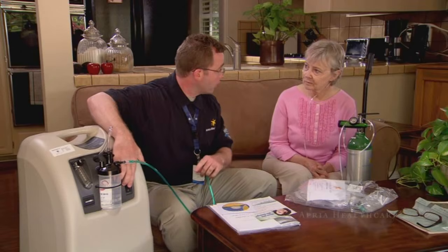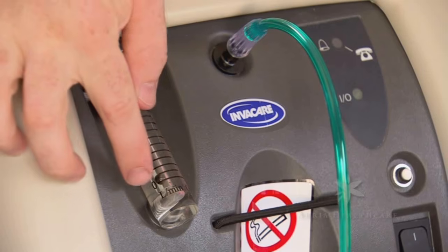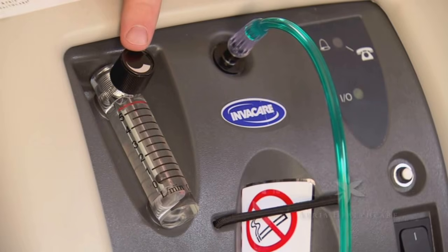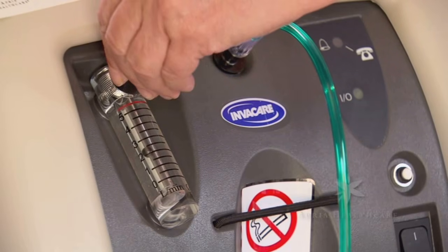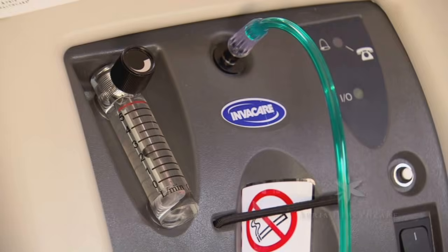Press the on-off switch to the on position. The alarm will sound until the proper pressure is reached. Adjust the oxygen flow rate by turning the flow control knob until the flow is at the number prescribed by your doctor. Again, you should not change the flow unless your prescription changes.